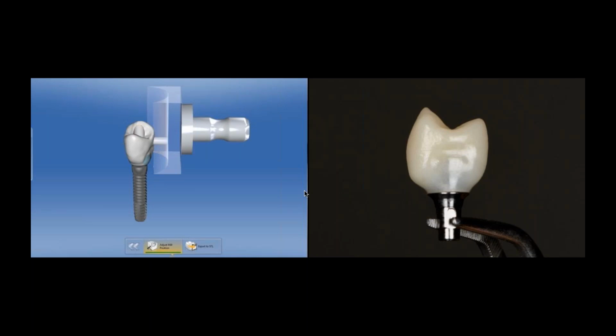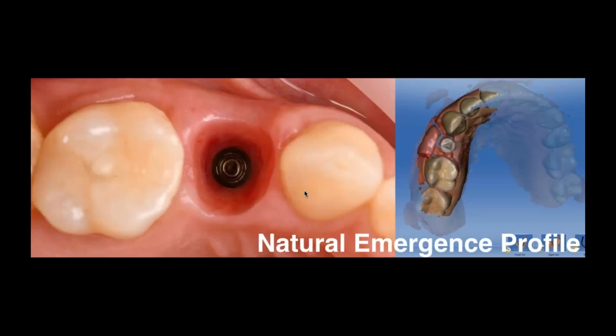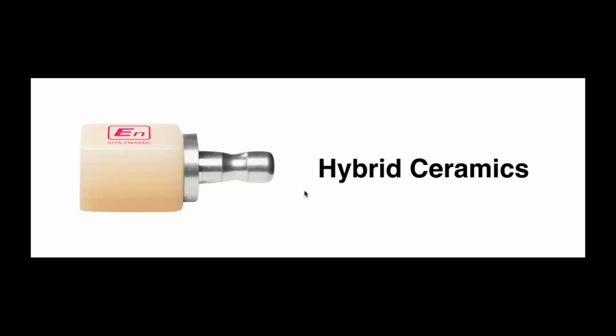And sometimes you see your patient more than 6 months after that, but the advantage of using these types of materials is the soft tissue response, because here I'm not relining with flowable composite and polishing and adding a little bit more for the contour and the critical contour area. I design everything in the software. I just put a block and mill it out, and I can have very nice soft tissue maturation. So this is the VITA Enamic hybrid block. As I said, it comes in the multicolor block. The most apical part of the block is more saturated, and the most coronal part is more translucent, okay?